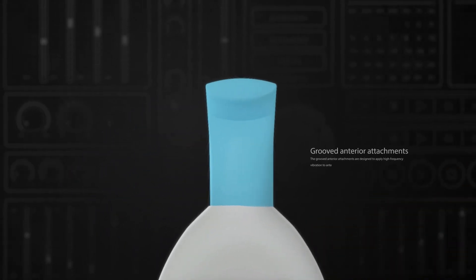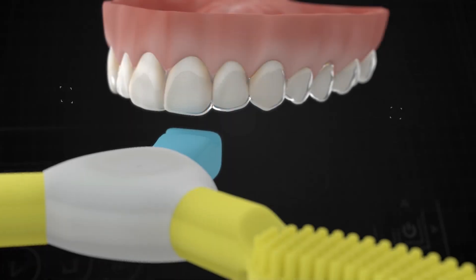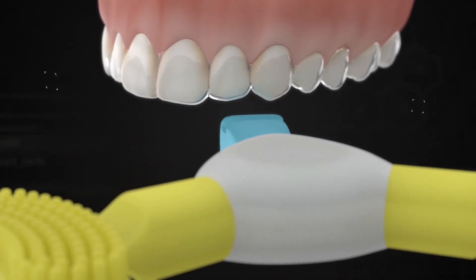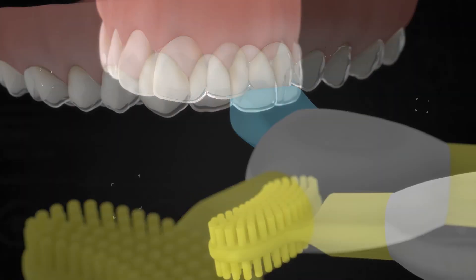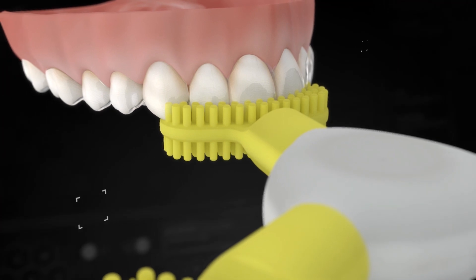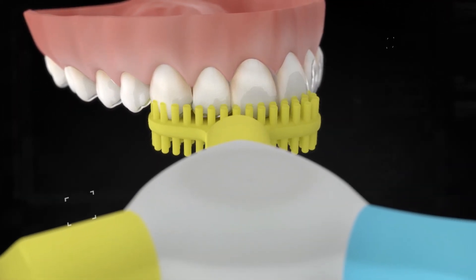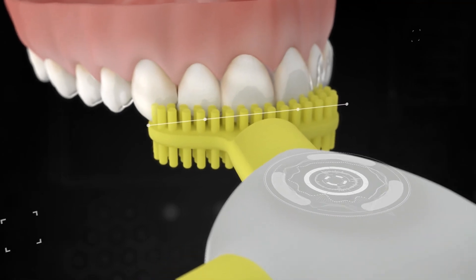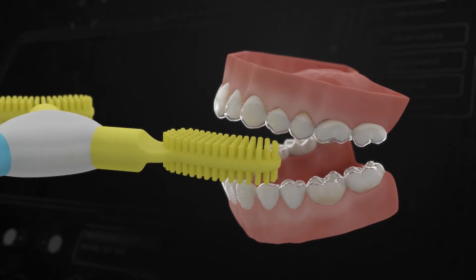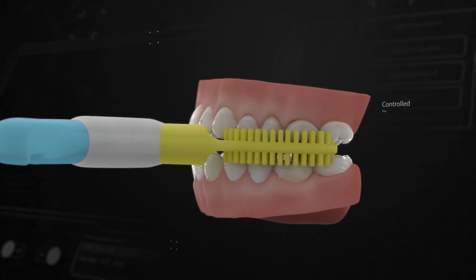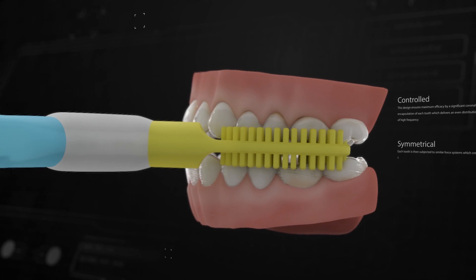The grooved anterior attachments are designed to apply high-frequency vibration to anterior teeth which may be lagging during treatment. This design ensures maximum efficacy by significant coronal encapsulation of each tooth which delivers an even distribution of high-frequency acceleration forces. Each tooth is then subjected to similar force systems which creates controlled and symmetrical acceleration.